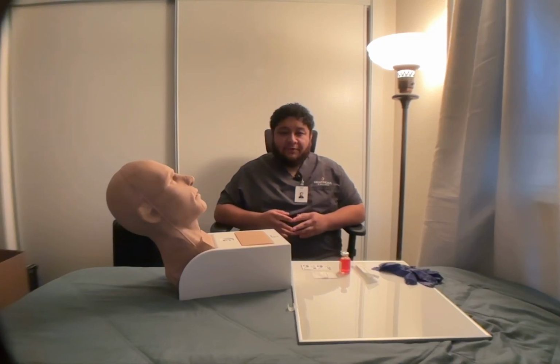Hello, my name is Christopher Jamie, and today I will be demonstrating the intradermal injection technique for a tuberculin skin test. I will be performing the skills videos today.